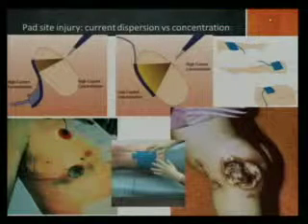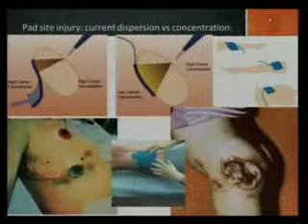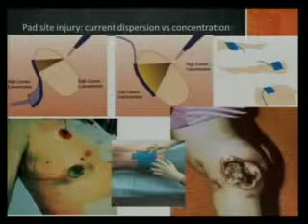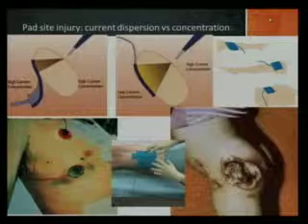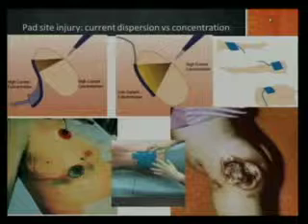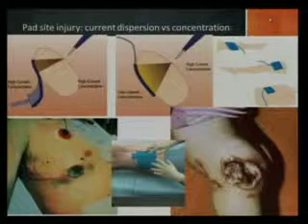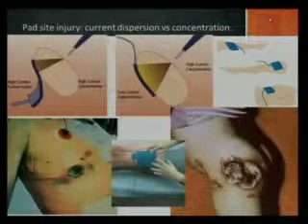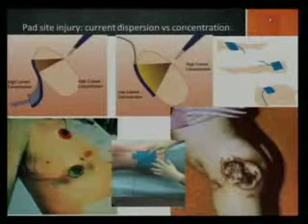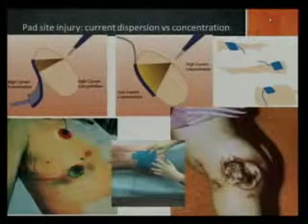So in the 80s, there was this technological advancement. If you look at the back of the pads that we place on the patients, you'll see that there's this strip in the middle, and then there's two sticky sides. The reason is that the electrosurgical generators read both sides separately, and they can tell if there's a difference between the contact quality and quantity between the two sides. If it's detected, the machine will a lot of times make a noise, have a light go off, or it will just stop. And that's really decreased this problem for us.